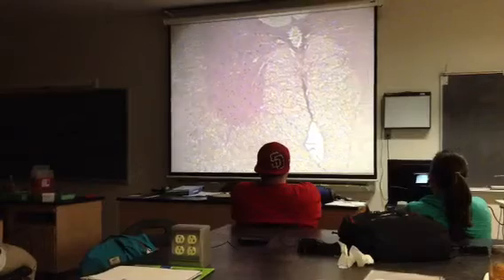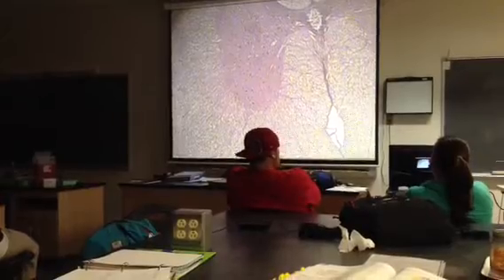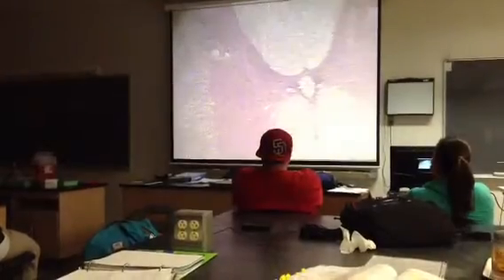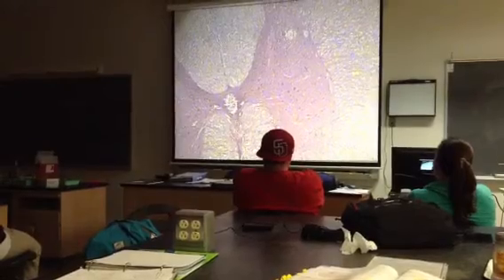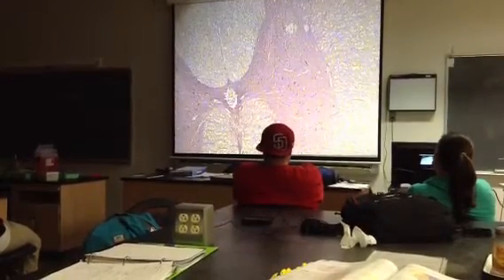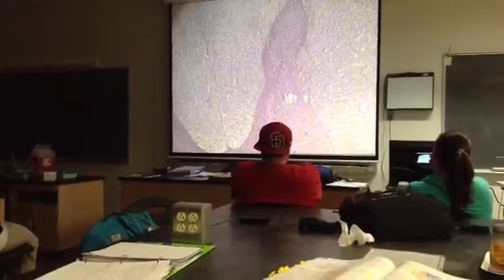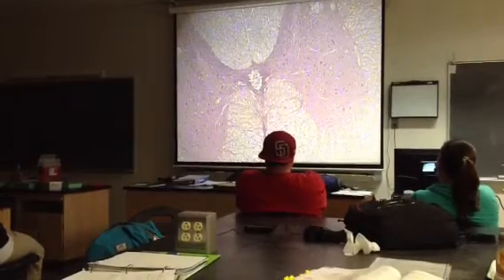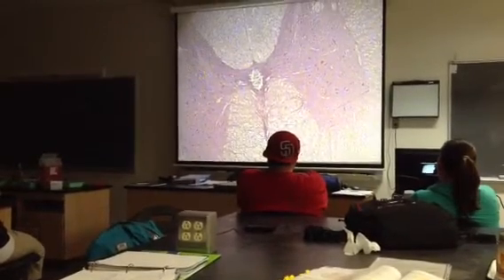Okay, so you need to know the different horns. How about this here? The anterior gray horn. Anterior or ventral gray horn, same thing. And the lateral gray horns sometimes are pretty tricky to discern, but it comes out a little bit right here. So here's the lateral gray horn. And then back here, what do you got right here? The posterior gray horn. Good. And then there's the two gray commissures. So what's this one? Anterior gray commissure, posterior gray commissure.